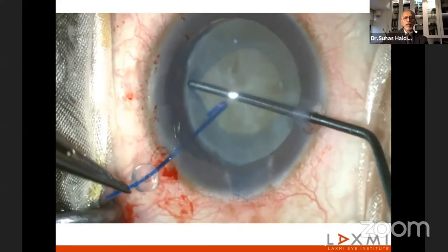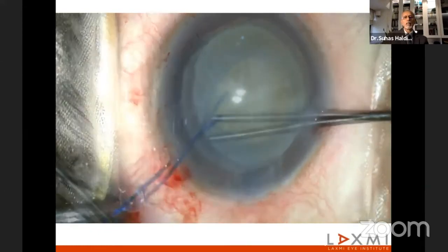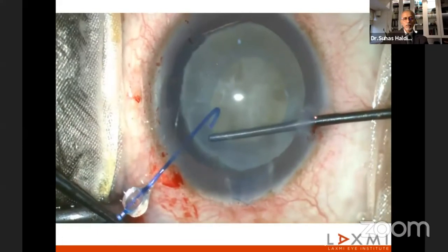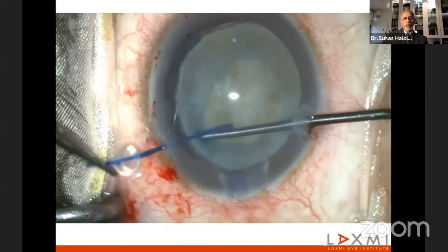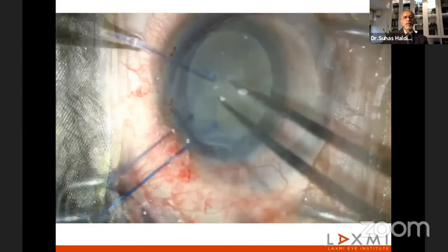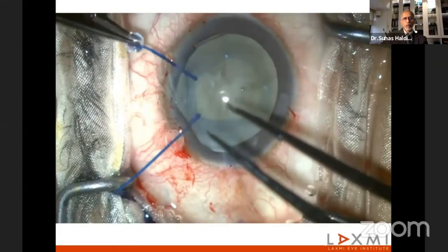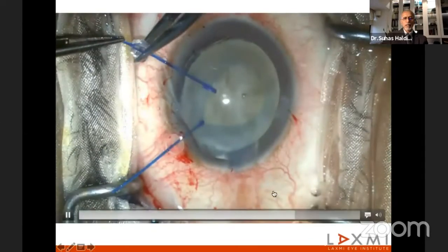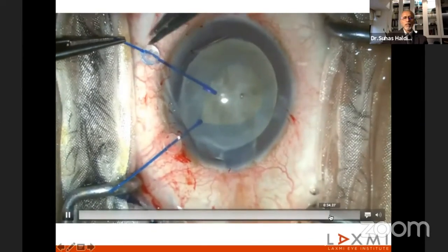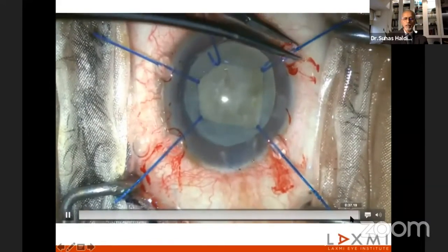It is just that you have to spend time to get some space and get your first hook in. Once the hook is in, then you have relatively good support on the bag, and the subsequent hooks are not really an issue. And in this case, I decided to have 5 hooks to be on safe ground.